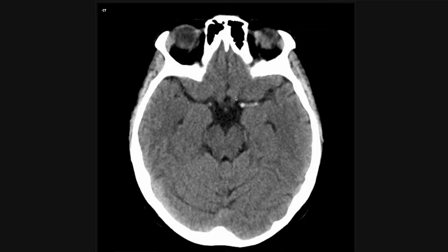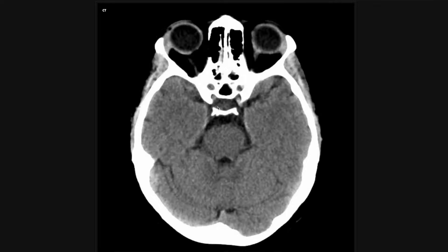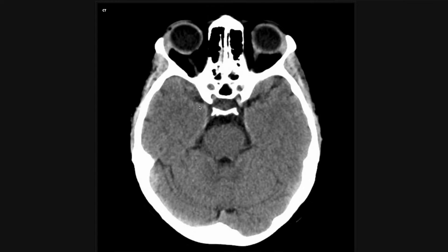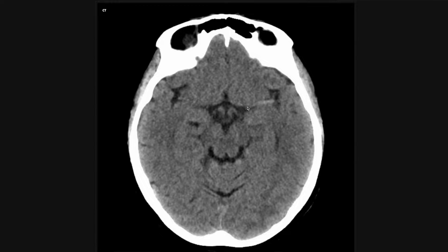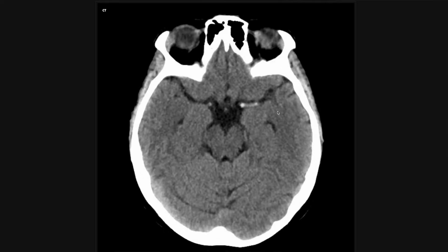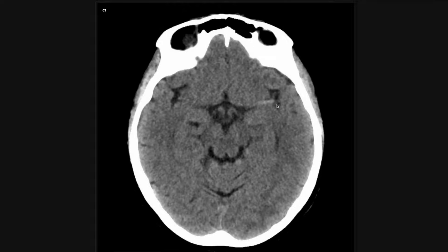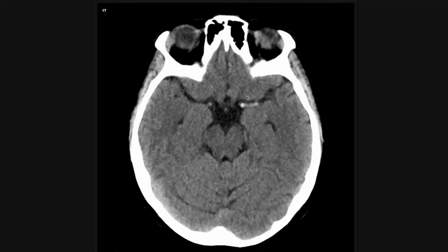This is the middle cerebral artery. Notice how bright it is when you compare it to the other side — on the right side it doesn't just pop, but on the left side of the patient it's very dense. It's dense because there is acute thrombus within the left middle cerebral artery, meaning that it is occluded and the patient is having an acute left MCA stroke.